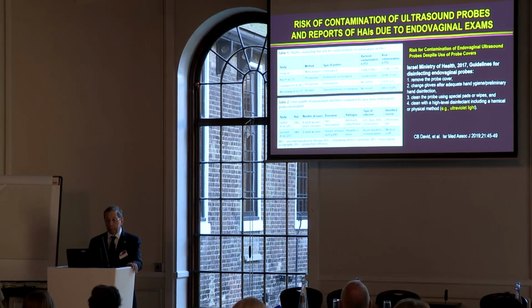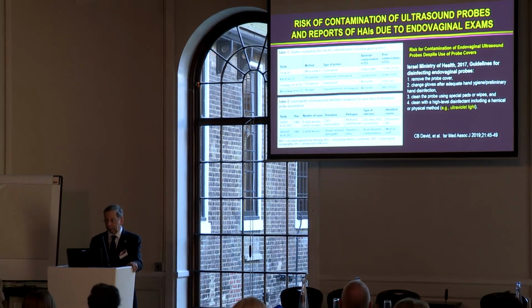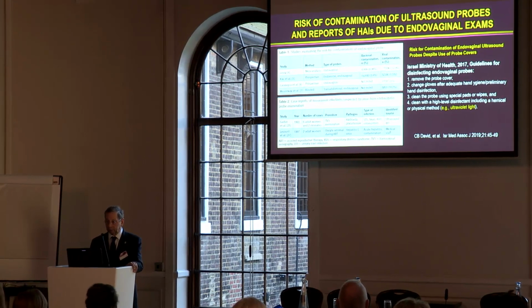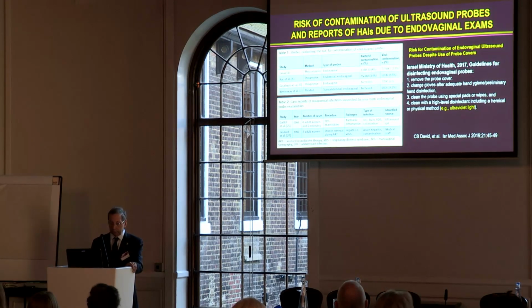Risks of contamination of ultrasound probes and reports of health care-associated infections due to endovaginal exams, in a paper just published in the Israeli Medical Association Journal. This was done by the Israel Ministry of Health. The 2017 guidelines for disinfecting endocavity probes: remove the probe cover, change gloves after adequate hand hygiene, clean the probe using special pads or wipes, then clean with a high-level disinfectant, including a chemical or physical method. And this is a direct quote out of the guideline. They included ultraviolet light as one of those possible methods.